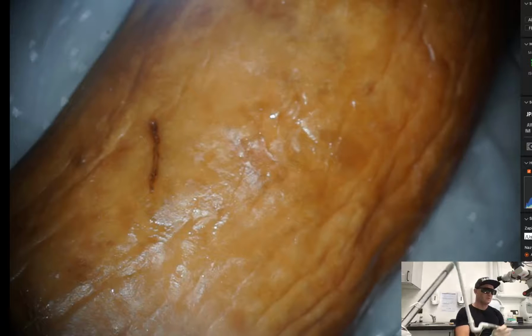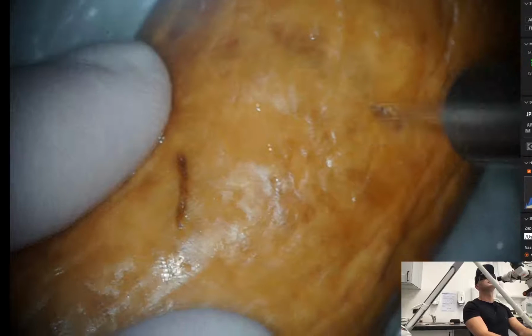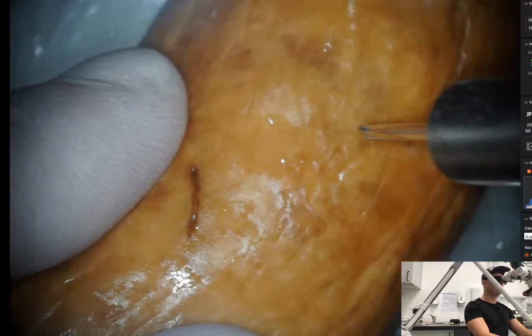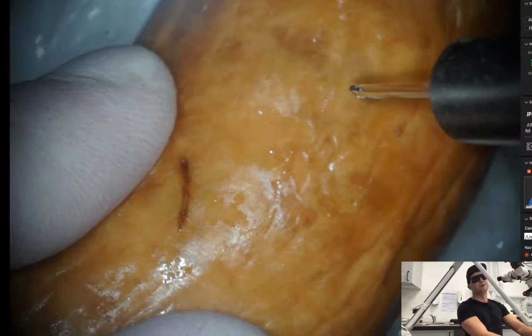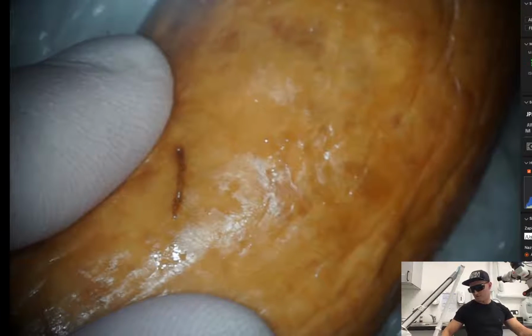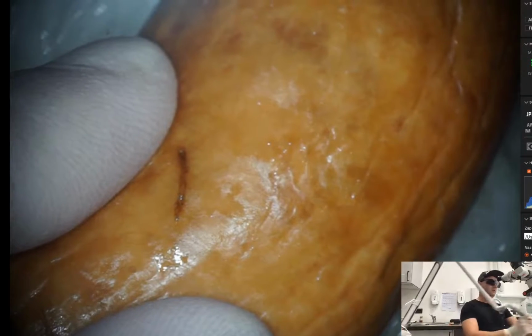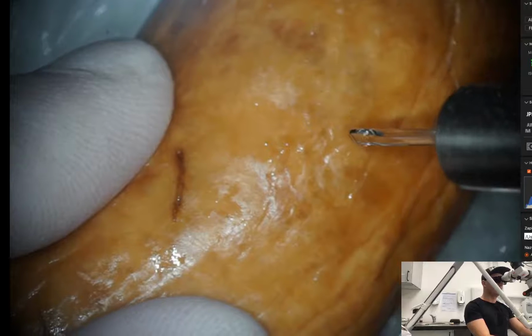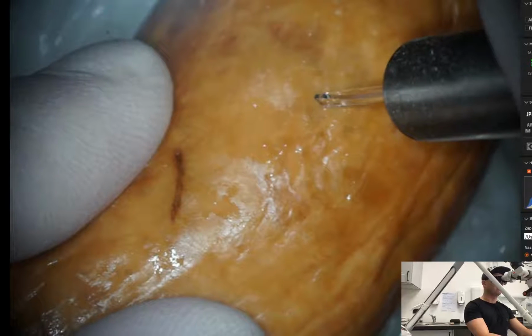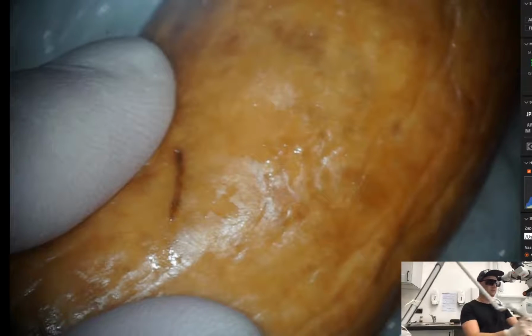So that's why we don't need to activate the tip, but we will be able to perform a cut in the soft tissue. So see what happens. We have adjusted a frequency of 10 Hz, and I will reduce the energy to the level for soft tissues. So it will be 120 millijoules and pulse duration 50 microseconds. And here we go. Let me just activate the device.